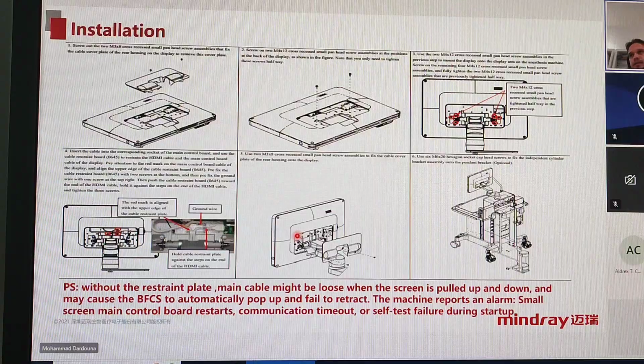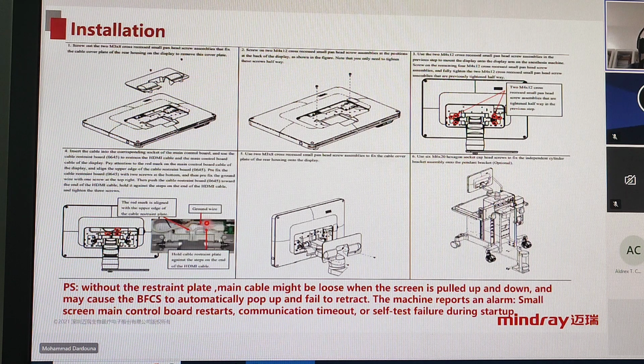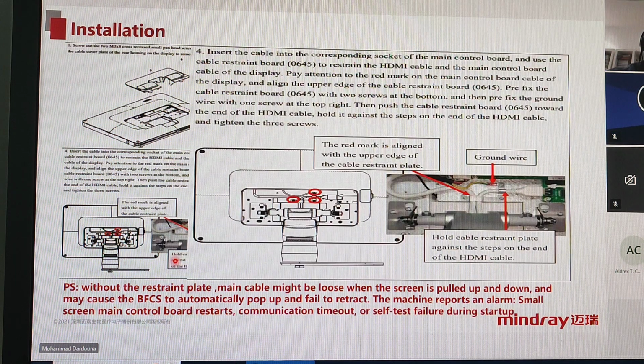Some of the anesthesia machines installed long ago had a problem with the length of these tubes. That's why there is a new part number for the tube with the exact, recommended length to make this loop during the installation. Okay, this is what I'm talking about.